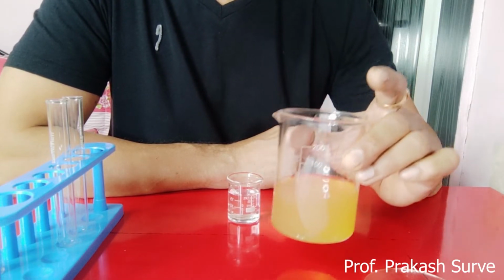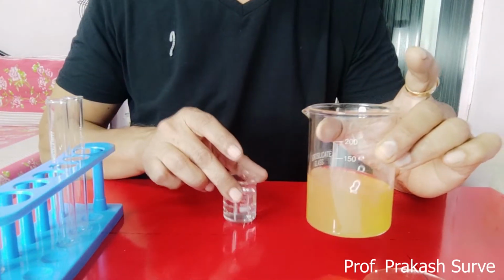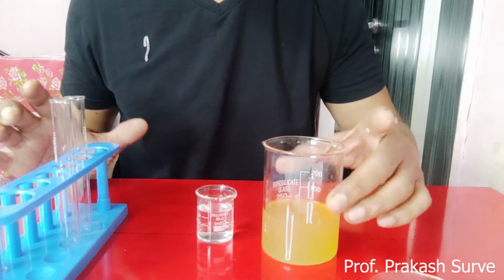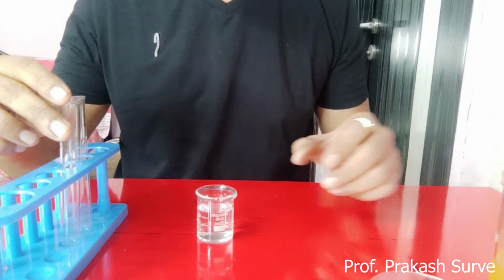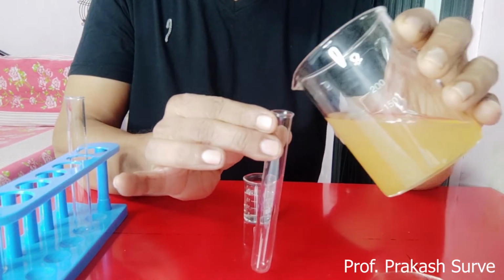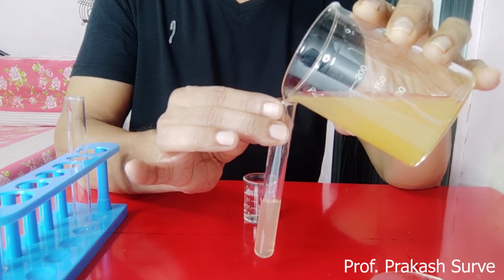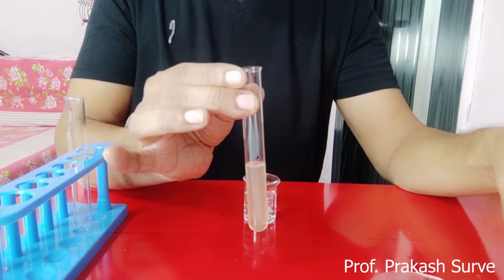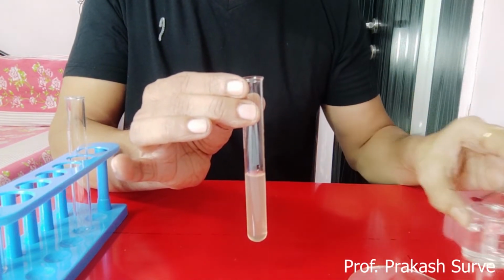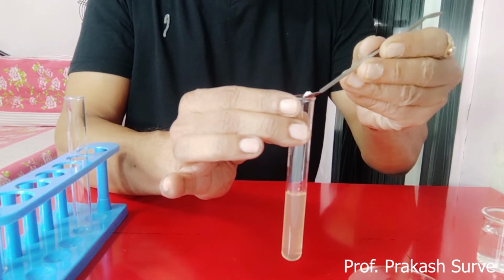Now we'll perform the test, for which the requirements are the urine sample, the plain water, the sulfur powder and the two test tubes. Now we'll perform it one by one. We'll take approximately half a test tube of the urine sample. Now we simply sprinkle this sulfur powder on the surface of this.